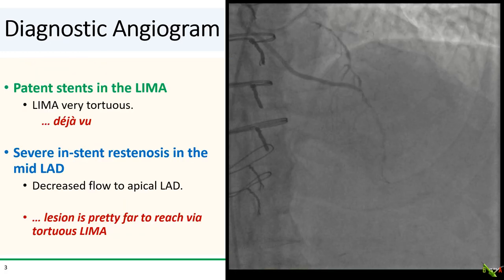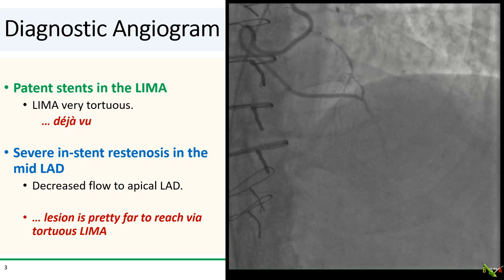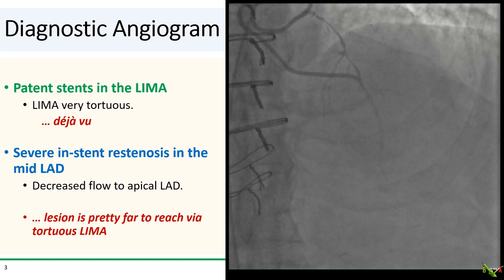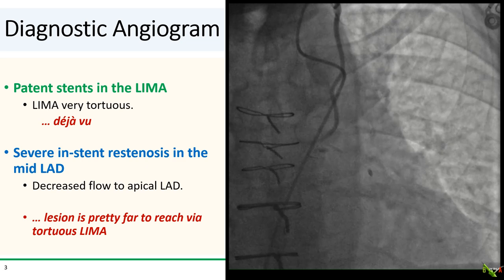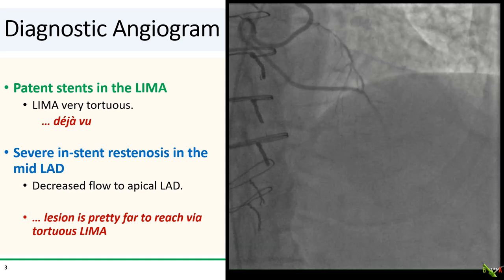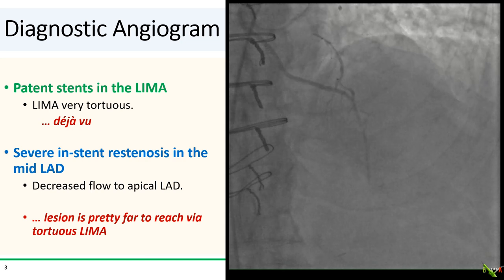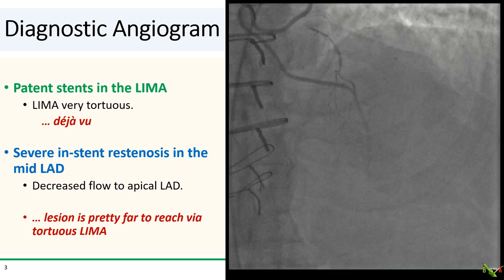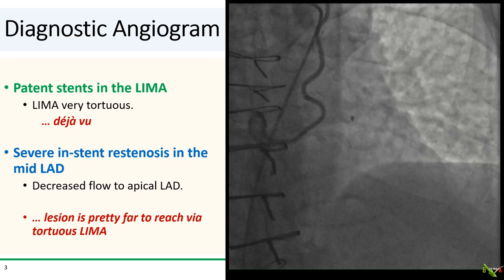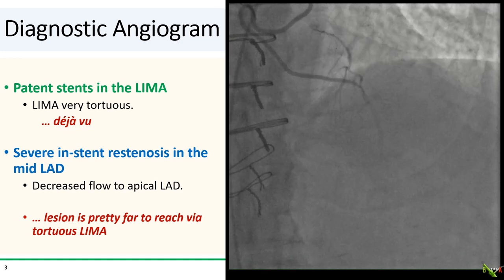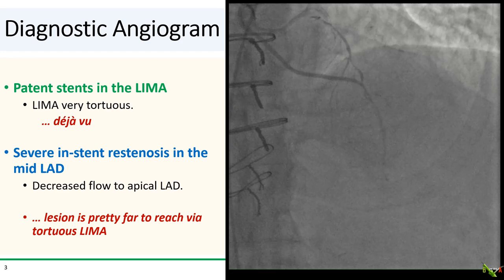What we see is that the previously placed stents in the LIMA are all widely patent. The LIMA is very tortuous, and we already know that we'll have difficulty wiring and passing equipment — we went over how to deal with all this in the stent embolization video. We also see that there is severe in-stent restenosis in the mid-LAD, and that flow to the apical LAD is severely compromised.